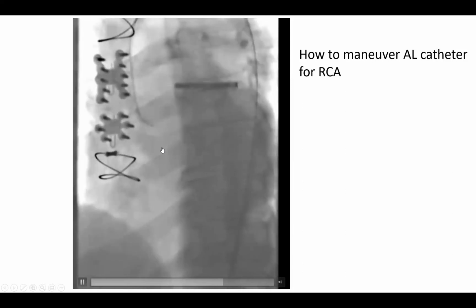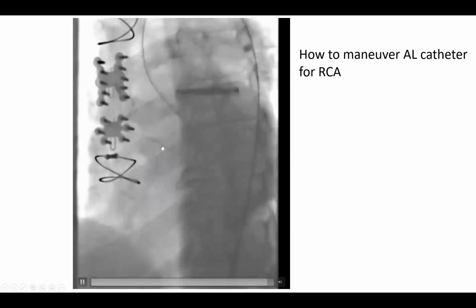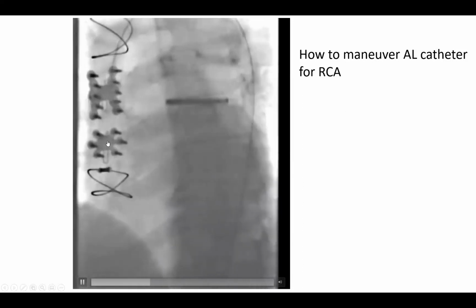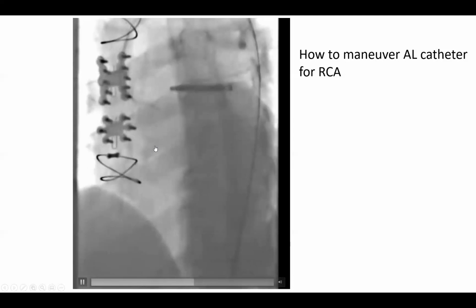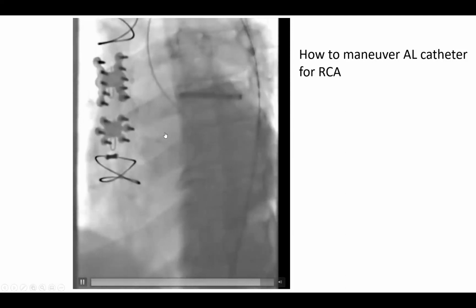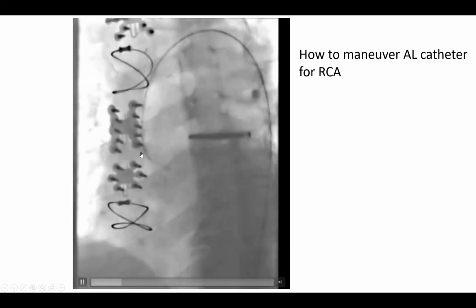Look at it again. That can work, except that I think he came too high. You know, it's always nice, when you want to engage the right coronary, you want it to be elongated, and you're clocking and pushing as you're engaging. I think the problem here is he probably clocked and got it to a duck shape too early.